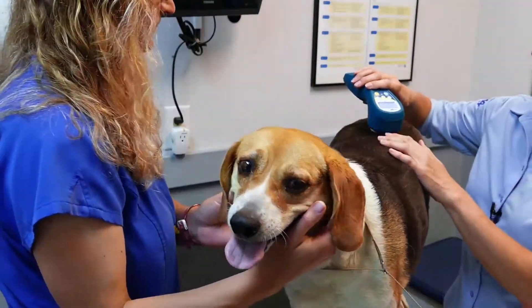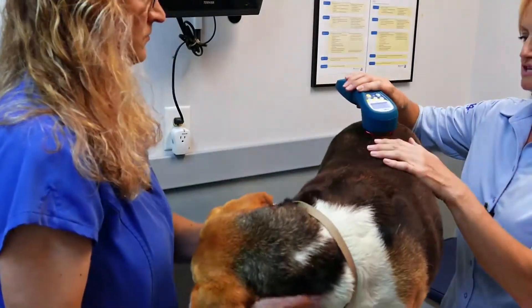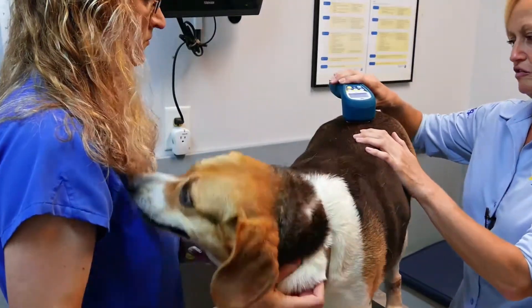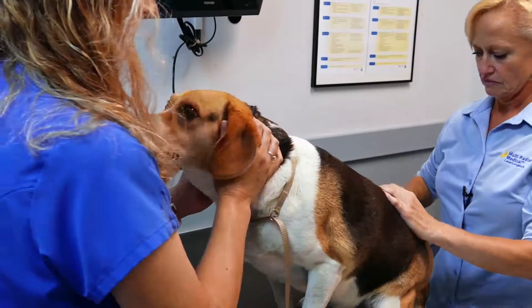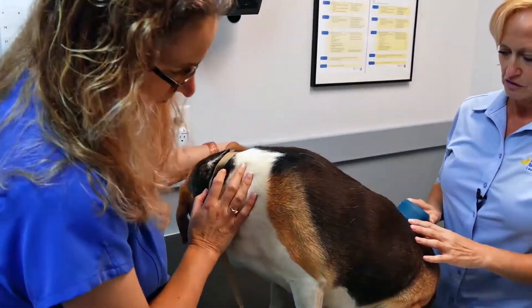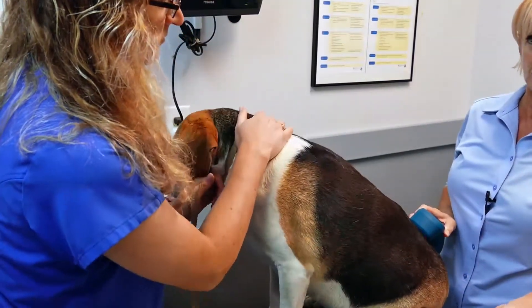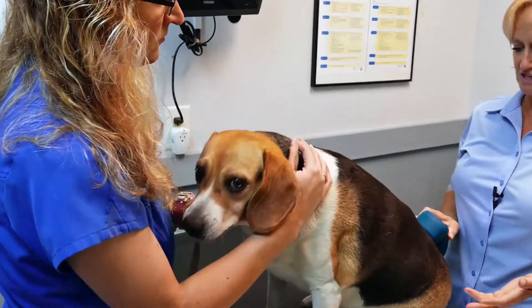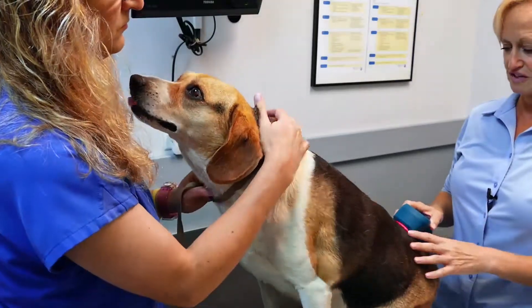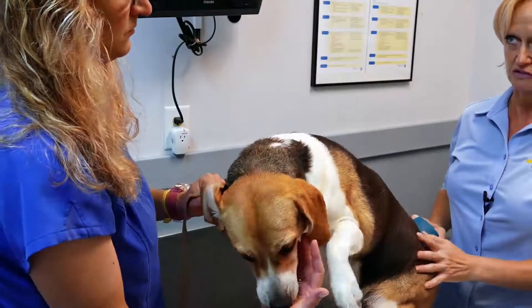Once you've determined whether you're trying to heal something or trying to shut something down, you've at least halved — you've minimized which setting you need to choose, Hertz-wise. So now you've only got half to choose from. For example, for a lick granuloma, you're trying to heal, so you would have already decided this is something I'm going to stimulate. Then out of the stimulatory settings — 5 Hertz, 50 Hertz, and 1 to 250 or straight 250 — you would decide which one is most relevant to dermal, which is the 50 Hertz.